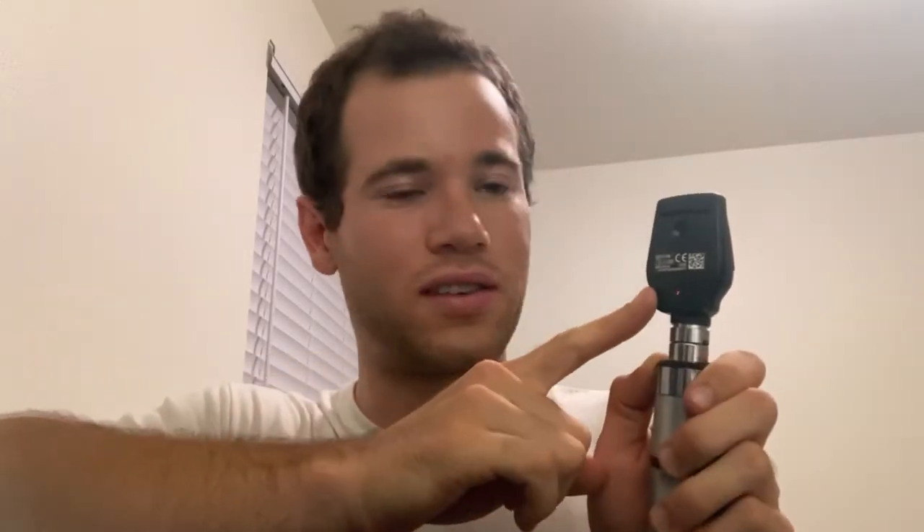You look at something about 10 to 15 feet away and keep switching the diopter setting — just like in an eye exam choosing between number one and number two — until something comes into focus. This calibrates the device for your eyes. In my case, because I am nearsighted, I can see the best at about six diopters on this. That's the whole point: figuring out the right adjustment for yourself.